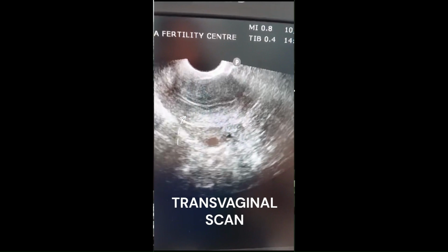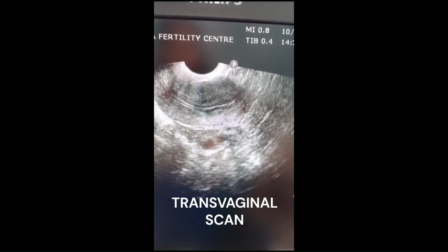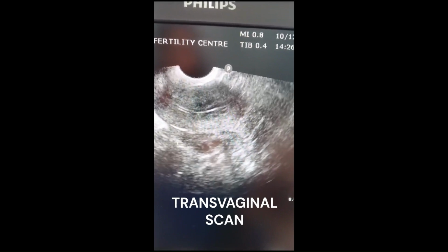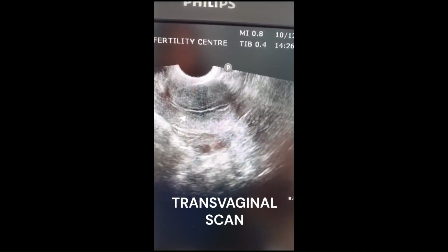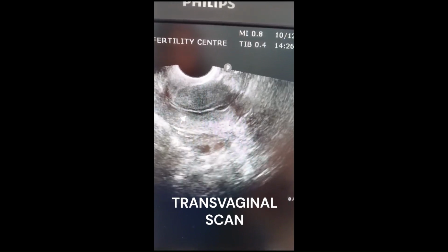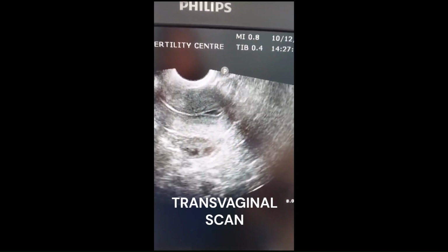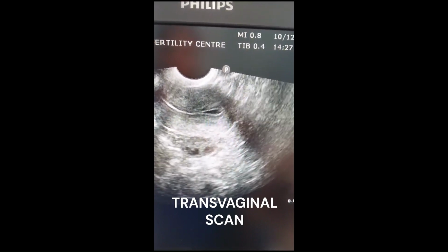In these patients, we first introduce the IUI catheter past the internal os level into the lower uterine cavity, and then we pass the transvaginal scan probe. This probe is pushed in such a way that the cervical canal gets occluded. Pushing the cervical canal, or pushing the cervix forwards towards the pubic bone, will occlude the cervical canal and also close the internal os.